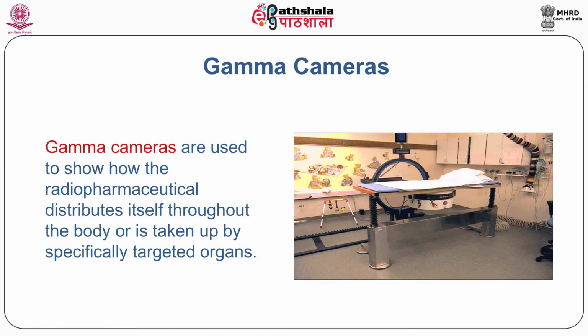It means either we talk about the rectilinear scanner or the gamma camera, which is an upgraded or updated version of the modality. But here you do not get a kind of dots, you get an image, like an X-ray image. The detectors give a 2-dimensional image of the organ which is emitting this kind of radiation, which is called a gamma camera.